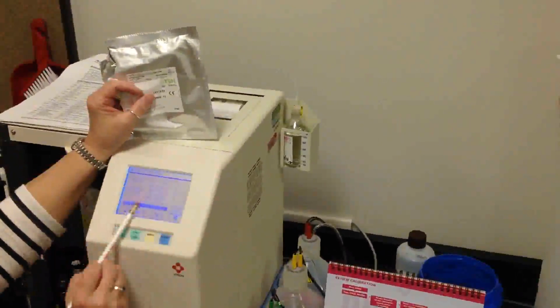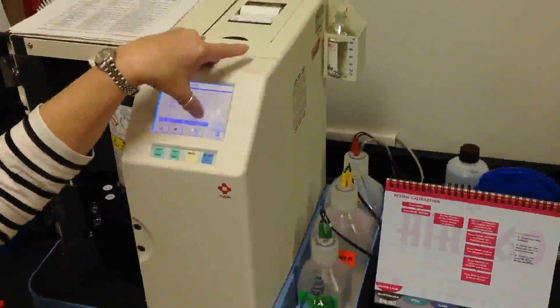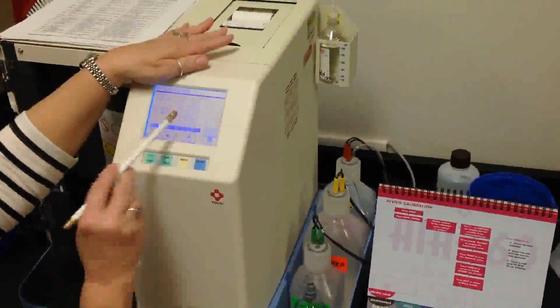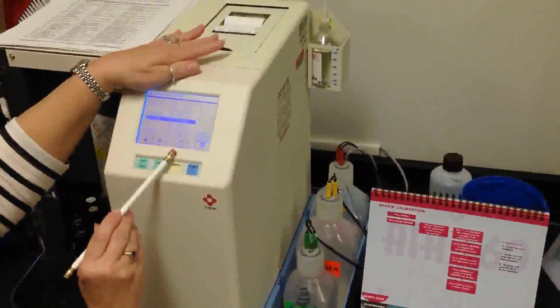Okay, for TSH, I have 1 dash, 1 with a slash, and 1 with the P. P is for pending. So I want to go back up to the other 72 and delete.